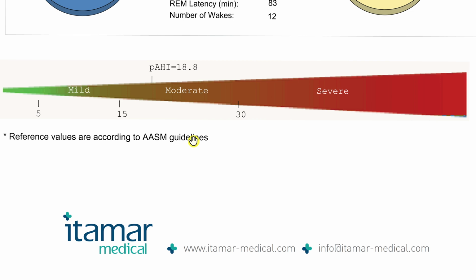Yes, AHI, and even more so RDI, are helpful metrics which can capture some cohort of the true sleep disordered breathing demographic. But, biggest but you've ever seen in your life, it marginalizes many others and very poorly represents the difficulty and severity that those patients are experiencing.